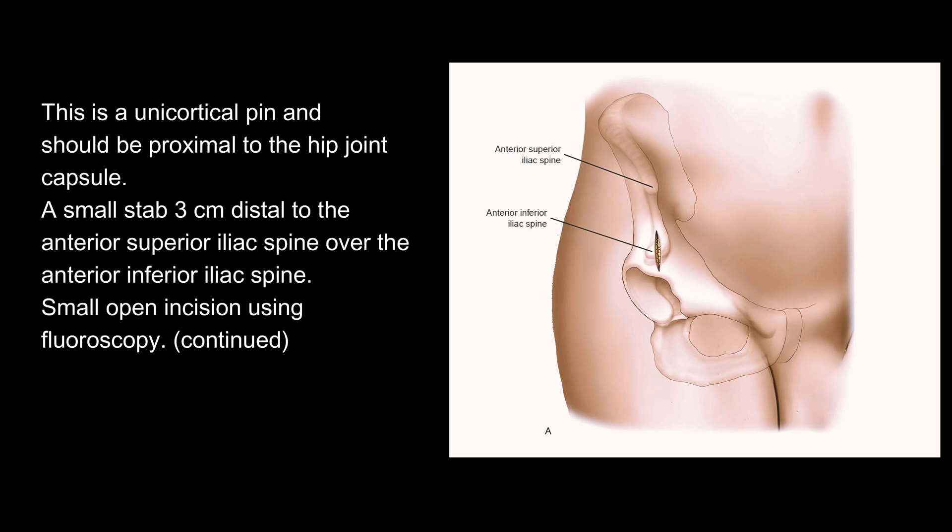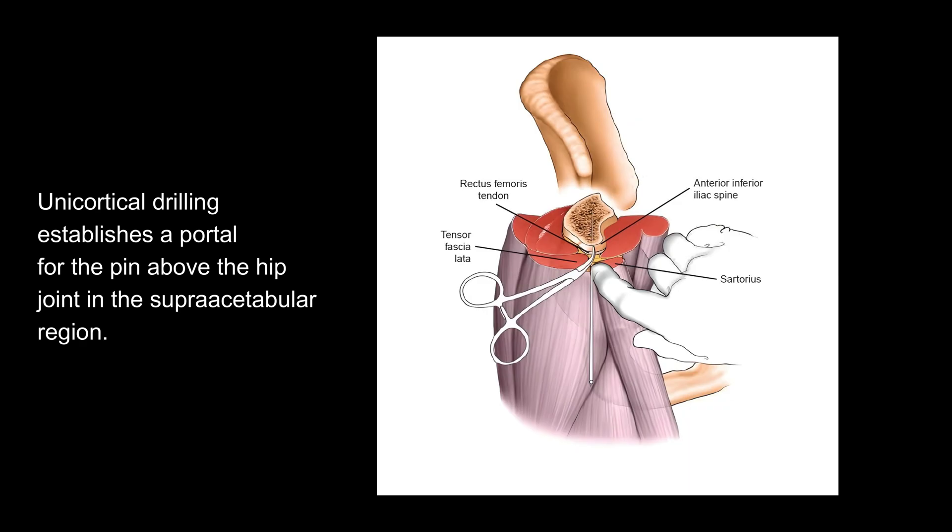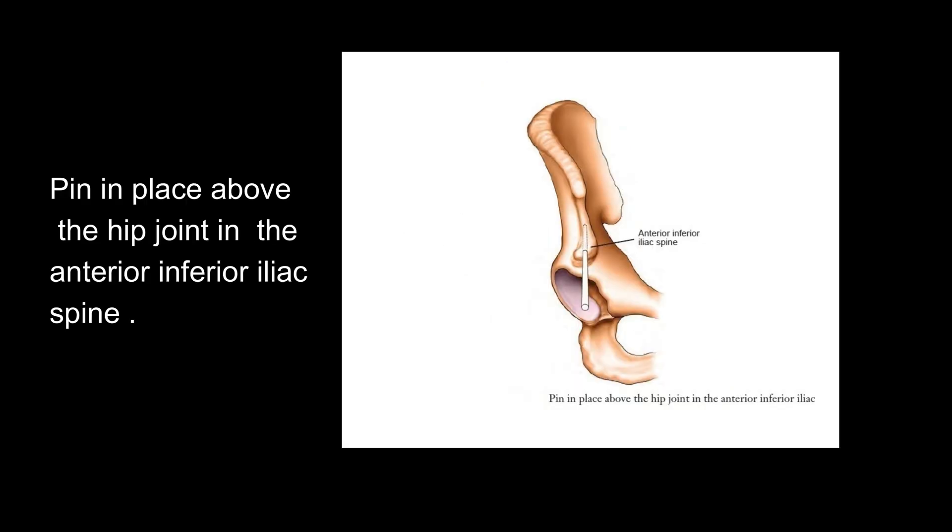A small stab 3 cm distal to the anterior superior iliac spine over the anterior inferior iliac spine. Small open incision using fluoroscopy. Continued blunt dissection finds the anterior inferior iliac spine. Unicortical drilling establishes a portal for the pin above the hip joint in the supra-acetabulum region. Pin in place above the hip joint in the anterior inferior iliac spine.